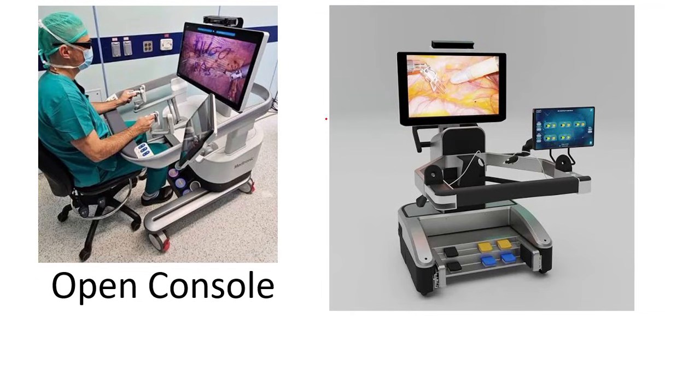So in the last video, I already discussed the closed console. Today I am going to discuss what an open console is and how it looks. If you see, this is an open console from Medtronic, this is from Hugo, and this is from SSI Mantra.